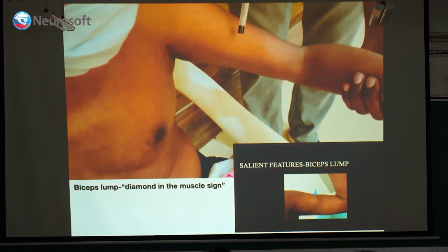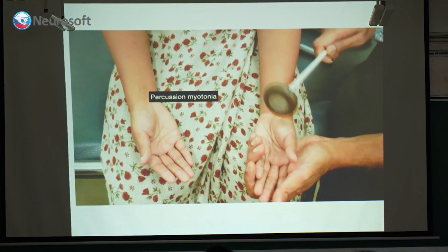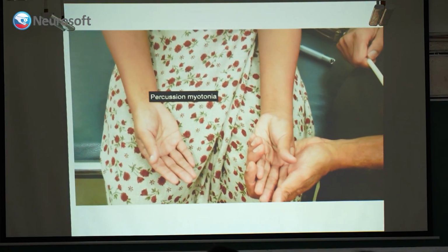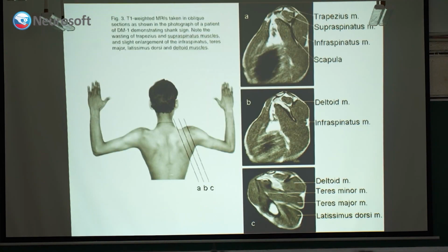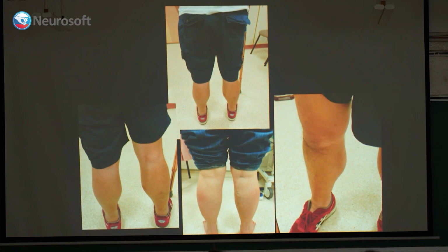Okay, so then this one I showed you all yesterday. I'm not 100% sure whether this is myopathic or neuropathic, because there is myotonia, percussion, and hypertrophic fibers can be picked up this way. Hypertrophy fibers, yes. Can I show the? I showed you all these patients.